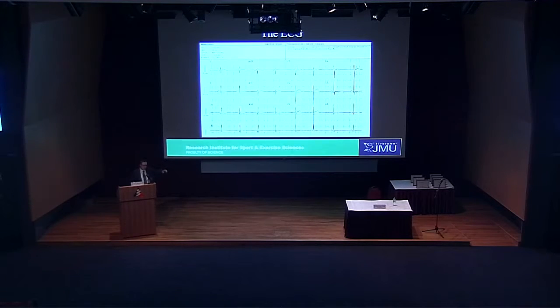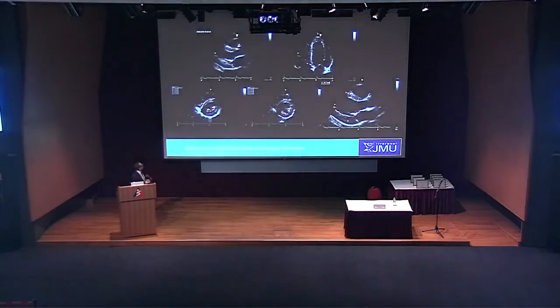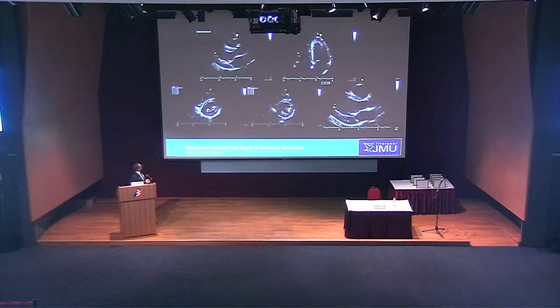John's presentation previously suggested that T-wave inversion laterally is abnormal. In some people, it can be normal through the leads, particularly in black athletes, but laterally, it's not usually normal. So this is starting to raise some alarm bells to me as an echocardiographer. So I go ahead and do the scan, and this is the parasternal, this is an apical view, but focused on the left ventricle.